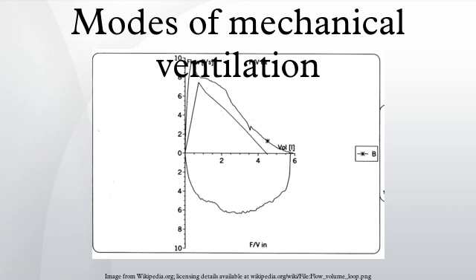The use of controlled mechanical ventilation requires the patient be completely unconscious, either pharmacologically or otherwise in a coma. Continuous mandatory ventilation is associated with profound diaphragm muscle dysfunction and atrophy. Continuous mandatory ventilation is no longer the preferred mode of mechanical ventilation.